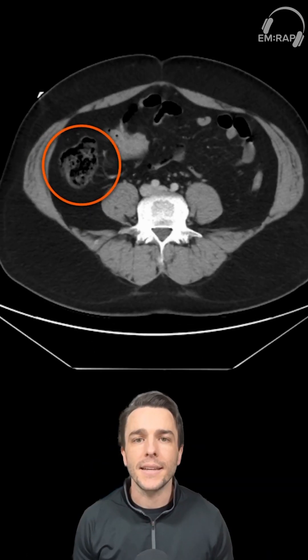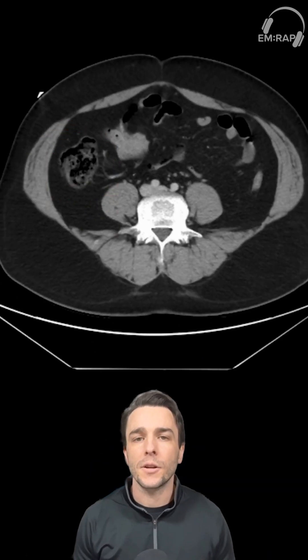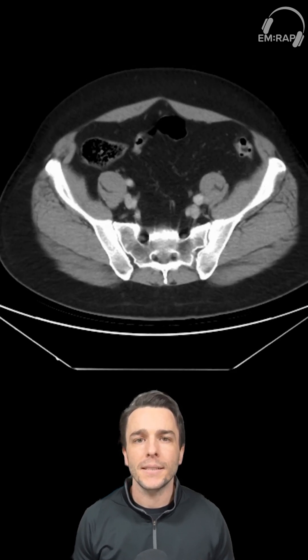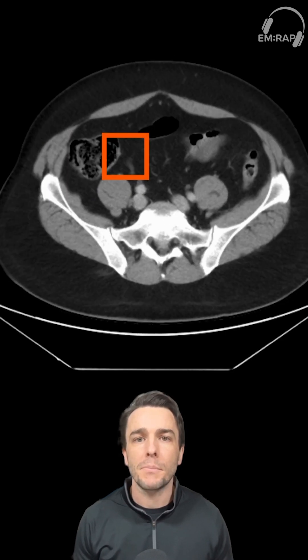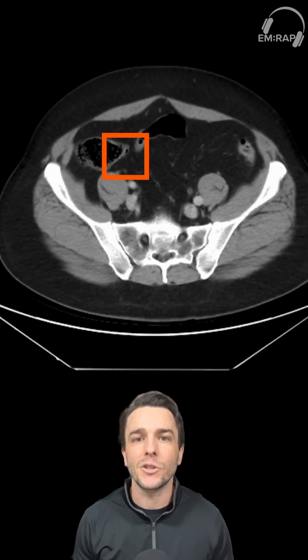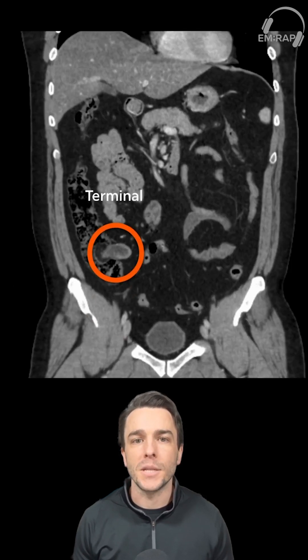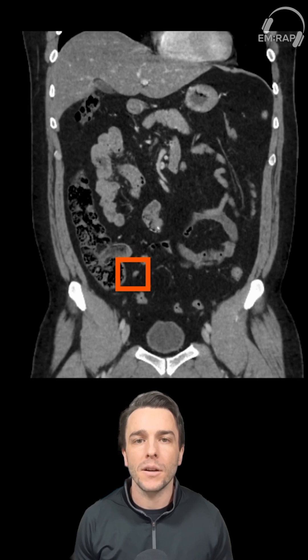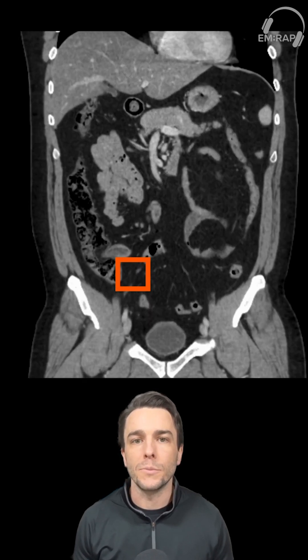You're going to start in the ascending colon and follow it caudally towards the cecum. Then you're going to look medially for the terminal ileum and where it inserts. From there, the appendix is just caudal from that ileocecal valve, and it should be pretty obvious seen as a small, blind-ending tubular structure projecting from the cecal base. The normal appendix has a maximal outer diameter of six millimeters and often contains intraluminal gas.